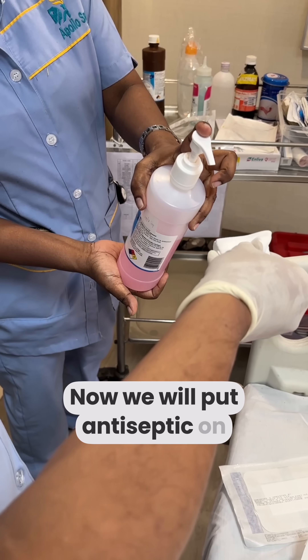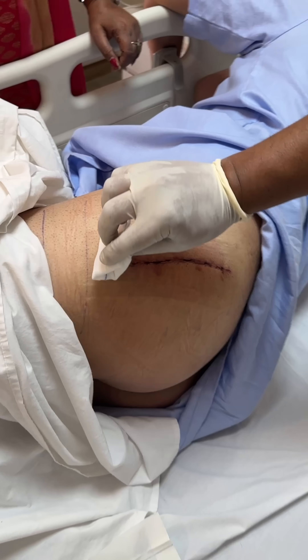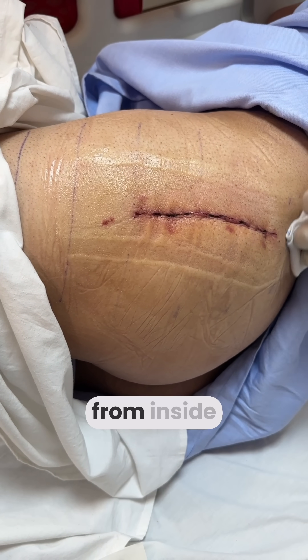Now we will apply the antiseptic. We will clean it well with the antiseptic. After that, we will clean it well along the stitch line, and then clean it well on the inside with the gauze piece.